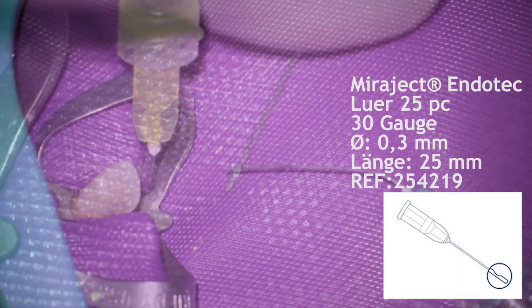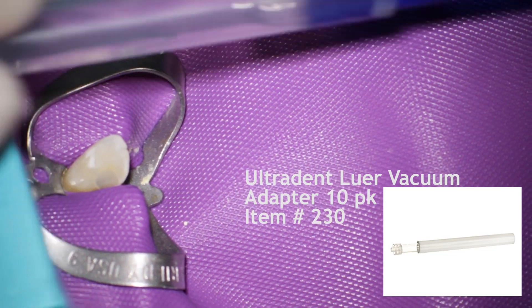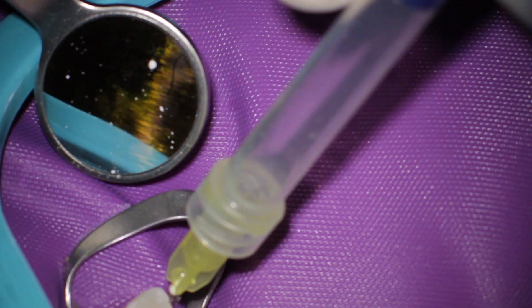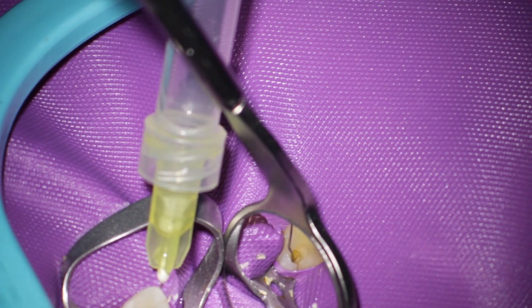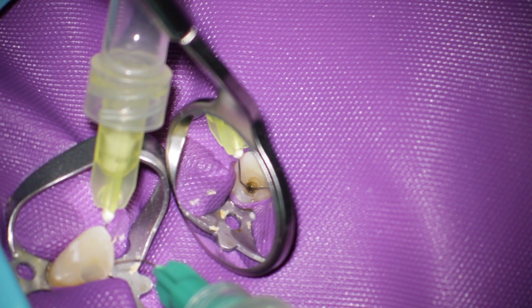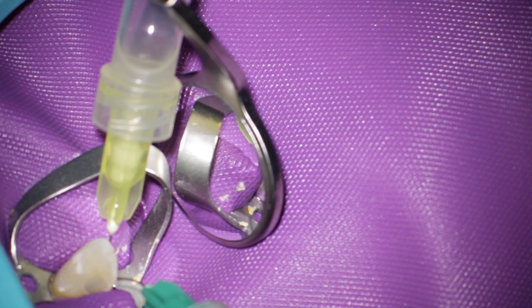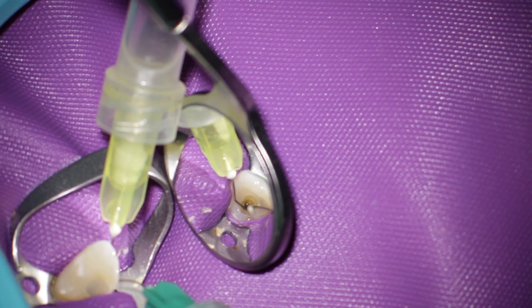I searched for the price of the endowag system and it was a very high price — about 400 to 800 euros. You can easily use the needles you have already seen. Each needle costs about 1 euro, and this needle is connected with a vacuum luer adapter from Ultradent. This needle has an exit on the side with which you can do the suction of the irrigation solution.